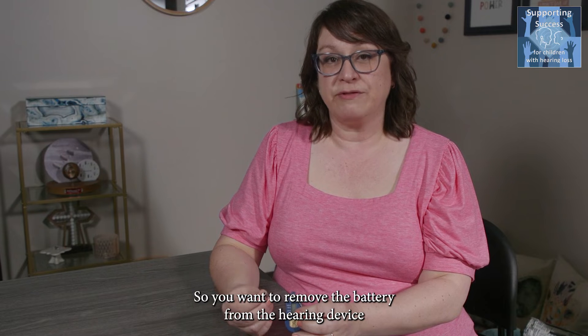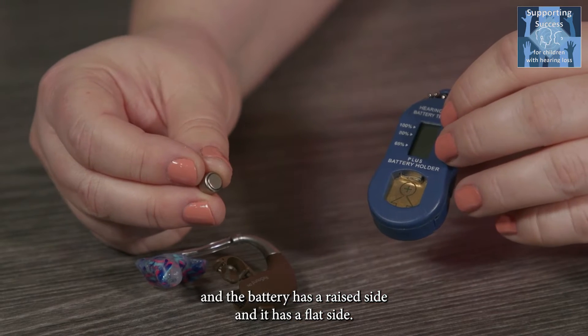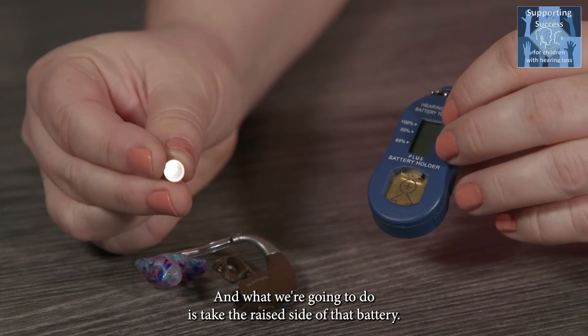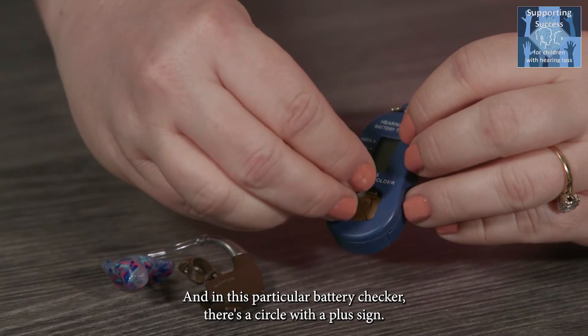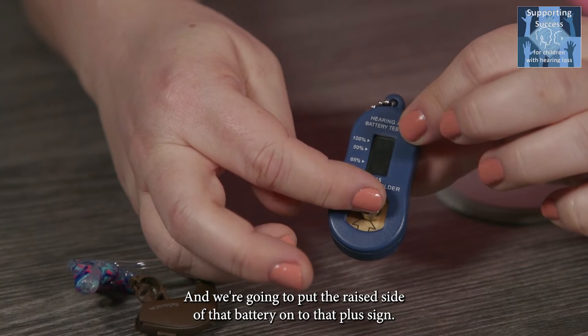Remove the battery from the hearing device. The battery has a raised side and a flat side. What we're going to do is take the raised side of that battery and, in this particular battery checker, there's a circle with a plus sign — we're going to put the raised side of that battery onto that plus sign.